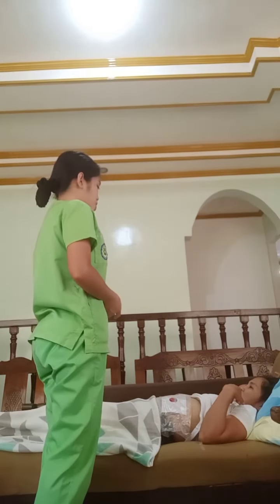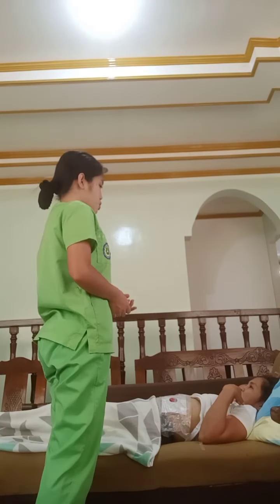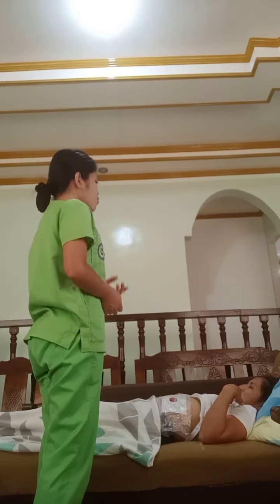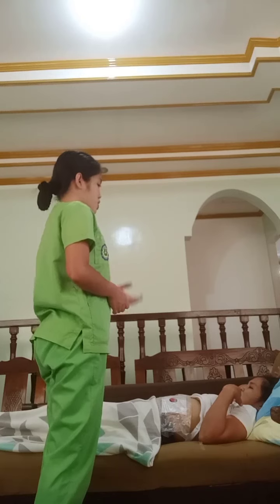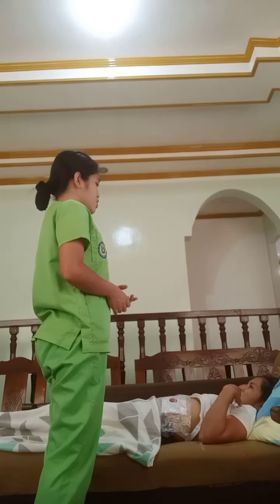So, good morning, Miss Reyes. I am Charmaine Vidal, your student nurse for today, and I'm going to perform colostomy care. This procedure will help you to be at ease and to promote self-esteem, and of course, for me to assess your peristomal skin. And explaining the procedure to the patient will help her to be at ease as well as to determine if she can cooperate.